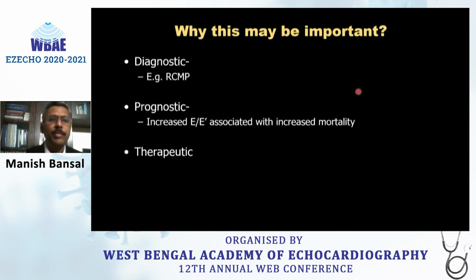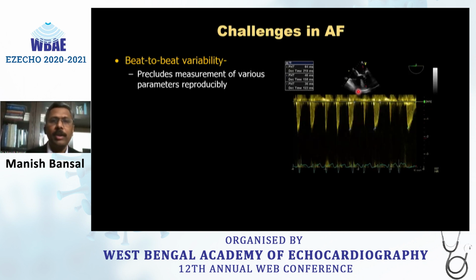And in this particular patient, EF appeared to be normal, but had it been reduced, then we would have been thinking about ICD also. So for that also, we need to have an accurate assessment of LVEF. However, assessment of cardiac function in AF is quite challenging for many reasons.